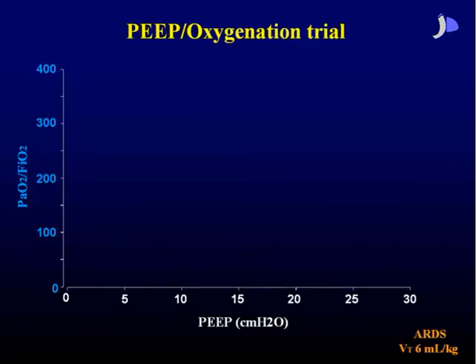So PEEP becomes a key issue in any recruitment ventilation strategy. But PEEP has to be seen in the context of recruitment. Only by applying PEEP, we can do more harm than benefit.